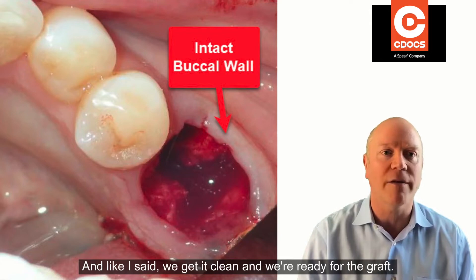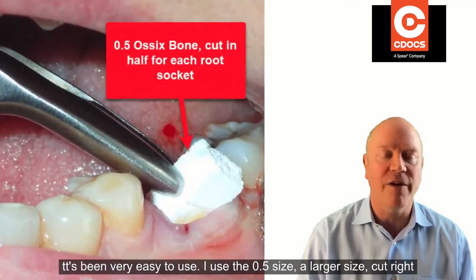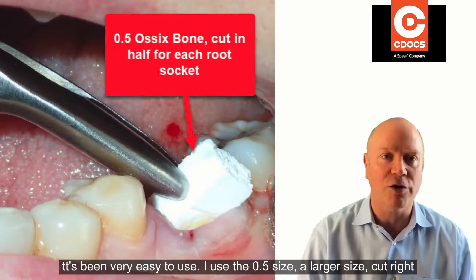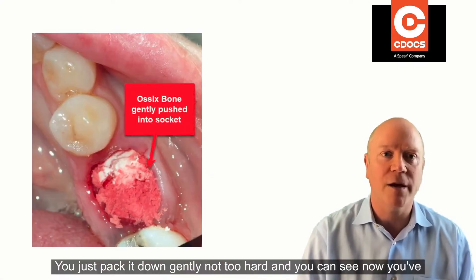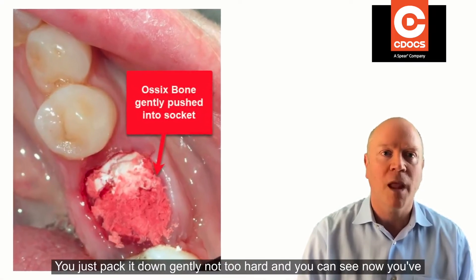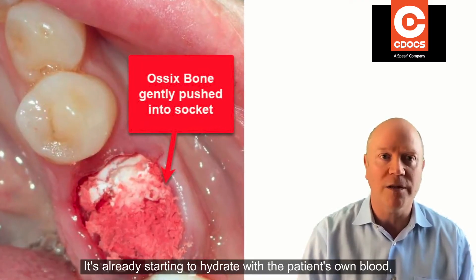We get it clean and we're ready for the graft. I like to use Osix bone — it's been very easy to use. I use the 0.5 size, the larger size, cut it right in half, and put a half into each root socket. It works great — you just pack it down gently, not too hard. You've got to compact it in there; it's already starting to hydrate with the patient's own blood.